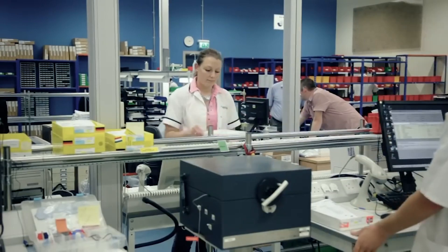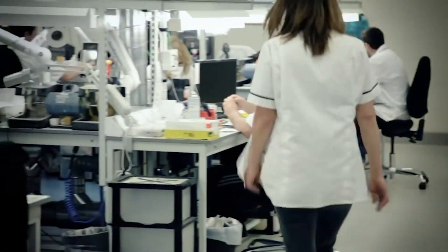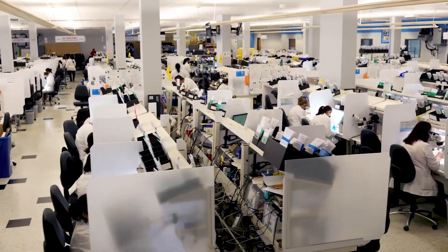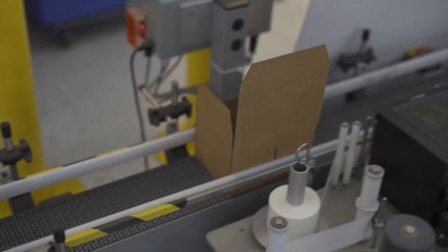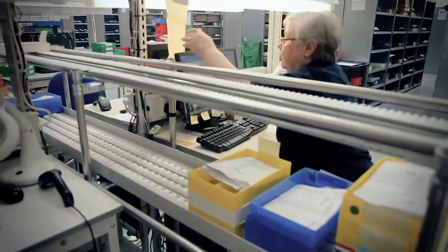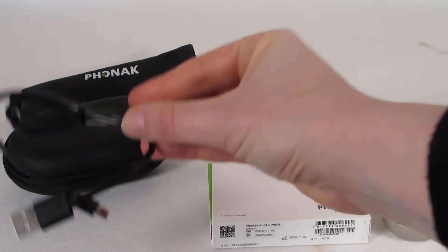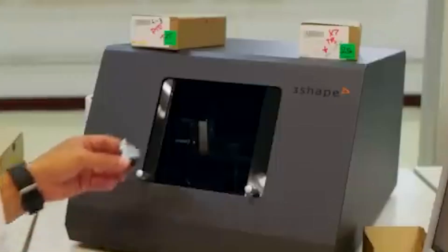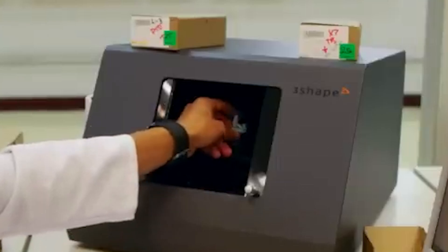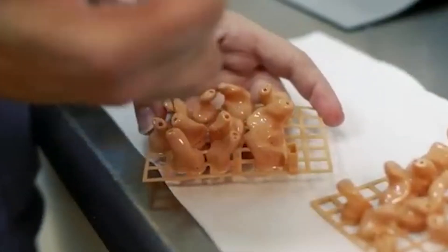Before the hearing aid is packaged and sent to the end user, a final round of testing and calibration is conducted. This ensures that the device functions accurately and consistently. Once the hearing aids pass all quality control checks, they are packaged for distribution. The packaging is designed to be user-friendly, providing clear instructions on usage, maintenance, and any additional accessories. Hearing aid manufacturers are continually investing in research and development to improve technology, enhance performance, and address the evolving needs of individuals with hearing loss.